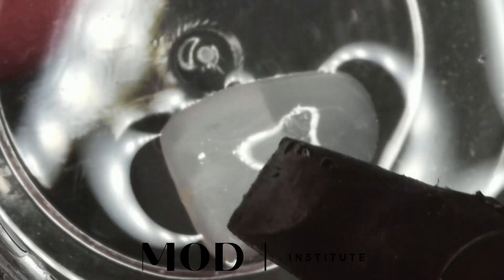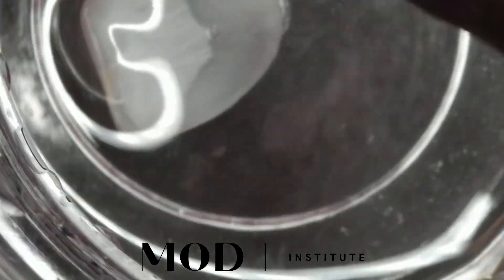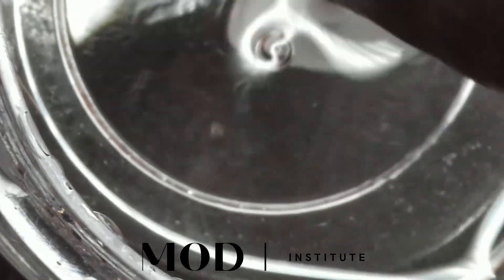Then you're going to go ahead and polymerize that — curing it. Now I'm going to throw that in a little tub of glycerin. Once it's initially tack cured, pop it in a little bowl of glycerin and pop it in — in this particular case — the nano cure. Once that's out, it's going to be pretty much done, with the optional ability to further hand polish.